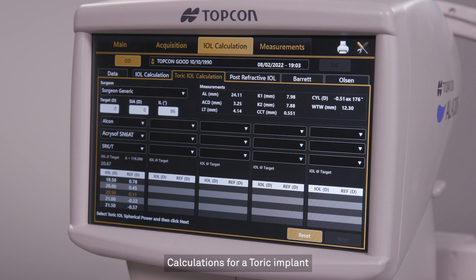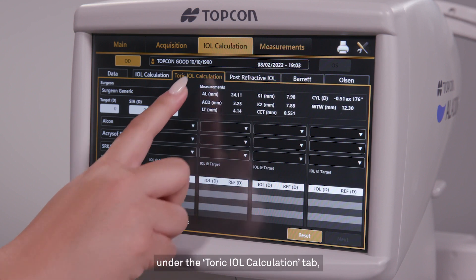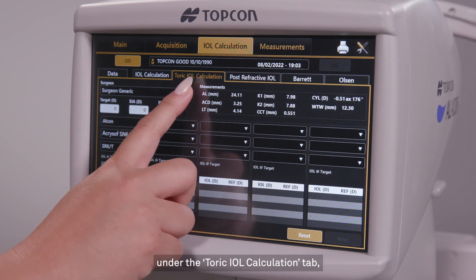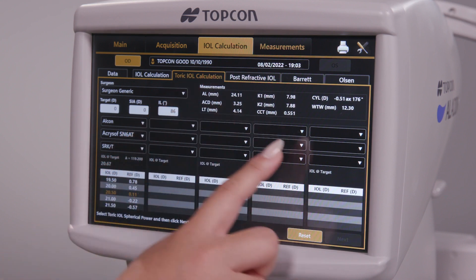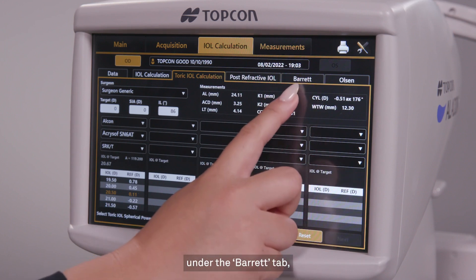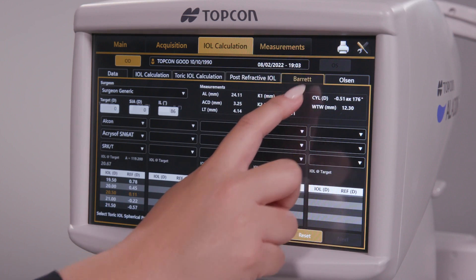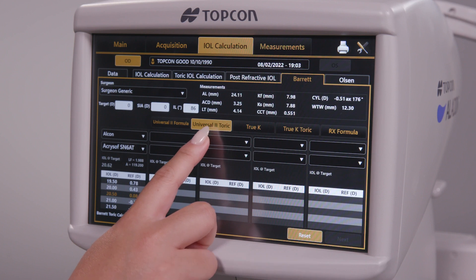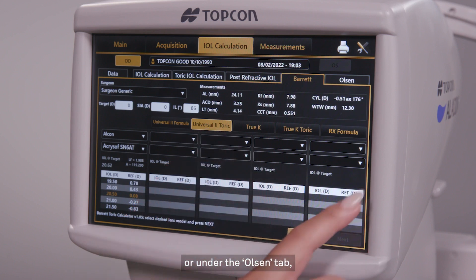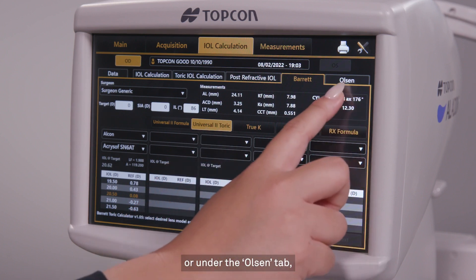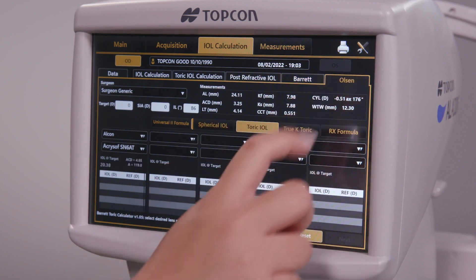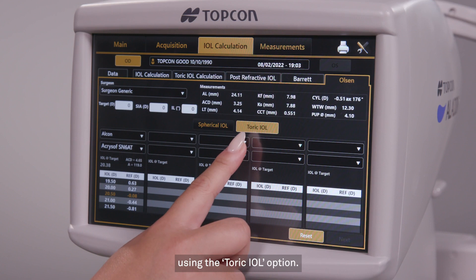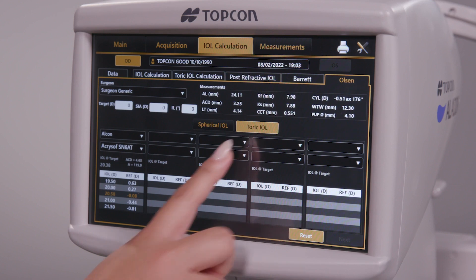Calculations for a toric implant can be performed under the Toric IOL Calculation tab, under the Barrett tab using the Universal II Toric option, or under the Olsen tab using the Toric IOL option.